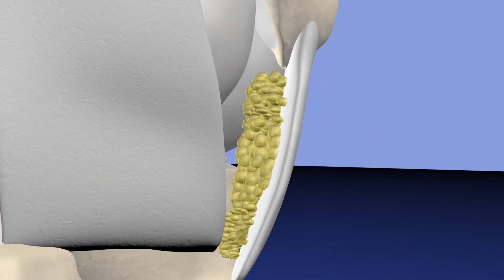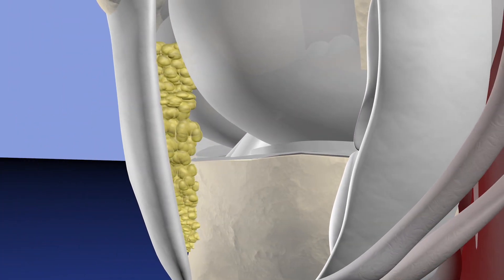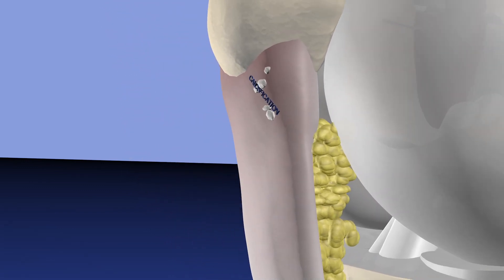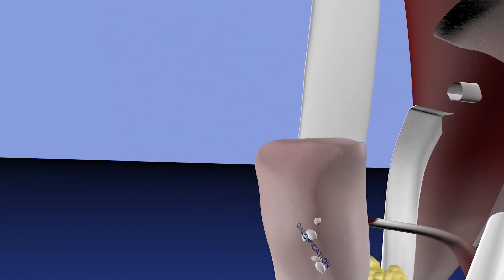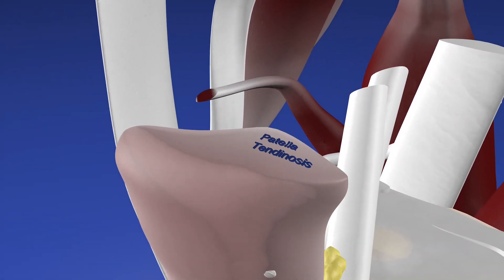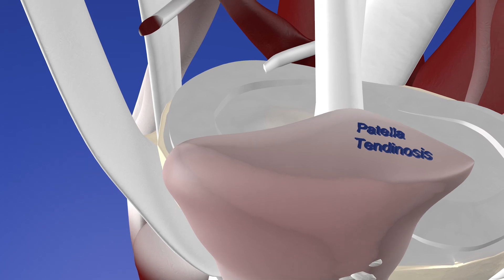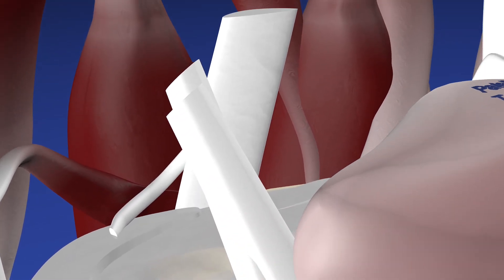Now we're going to look at some of the pertinent anatomy. Here's a normal patella tendon with Hoffa's fat pad just underneath that. You can see how it's kind of thin and cylindrical. And here's the thickened tendinotic tendon which is thickened proximally with some calcification proximally as well. And there's patella tendinosis somewhat off-center in this particular patient.